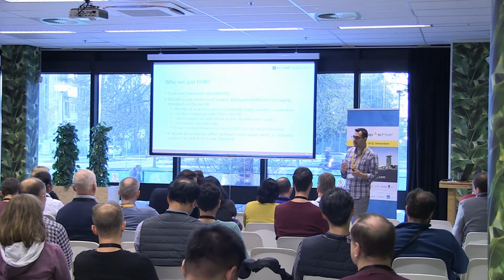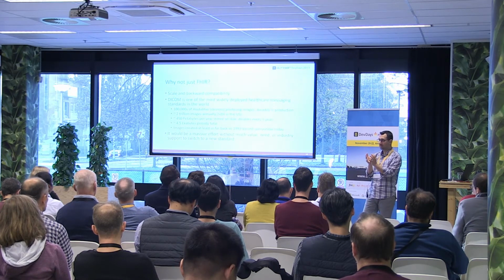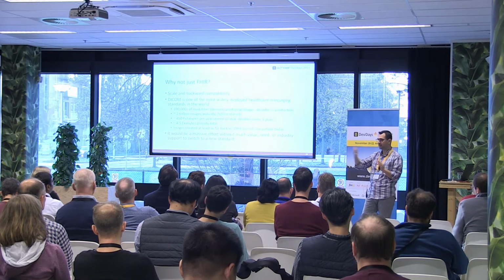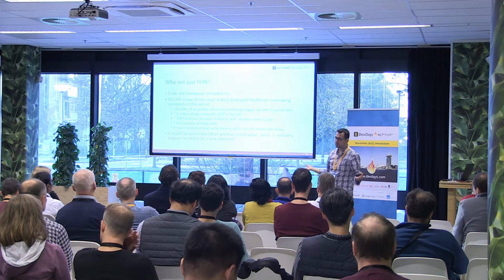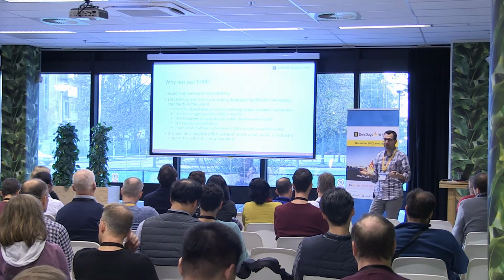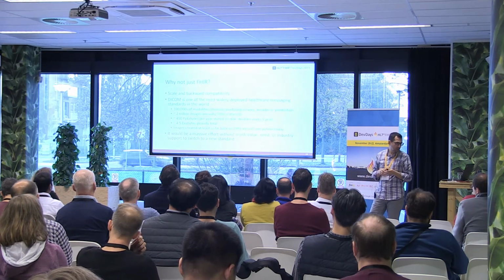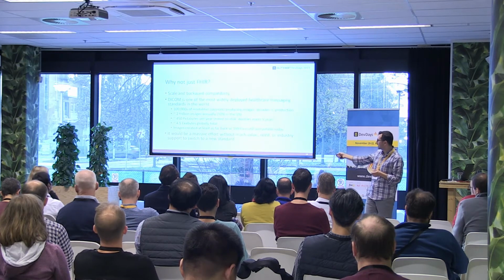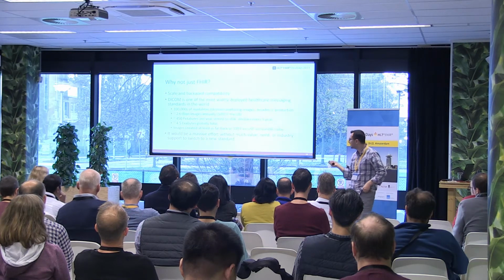So obviously FHIR is not necessarily geared towards storing that much data for an individual study, right? Take that and multiply it by how many studies a patient goes through in their lifetime, multiply it by how many patients you have in your hospital system, and you've got a huge number of studies and images that need to be stored and managed. The other one I was going to mention, there's some quick math here, if you want to get an idea. So 450 petabytes, something you'd be looking at.